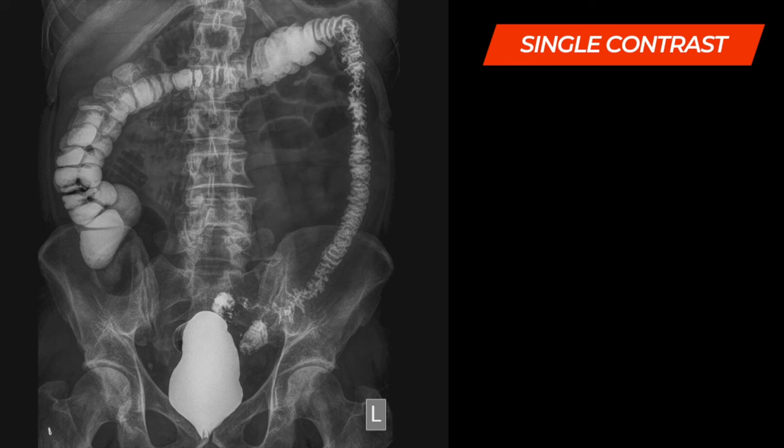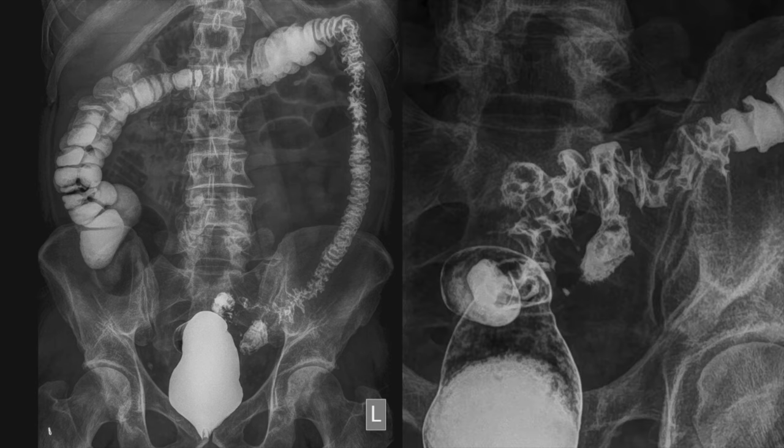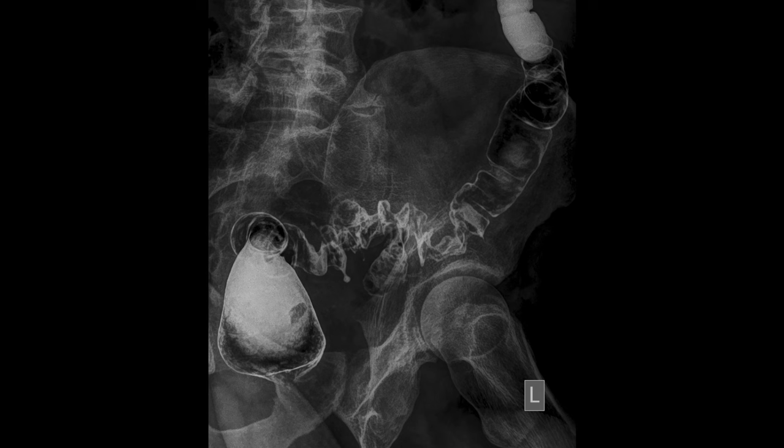Once this set of images is taken and viewed, ask the patient to pass out the barium by removing the tube and sending them to the restroom, or lower the barium can so barium returns into it for disposal. If more than half of the barium has come out, that's good enough. Now pass air through a BP cuff instrument attached to a tube re-inserted into the anal canal, and start insufflating air slowly to achieve good distension. Take one check film to confirm enough air is seen and the entire colon is distended from rectum to cecum.